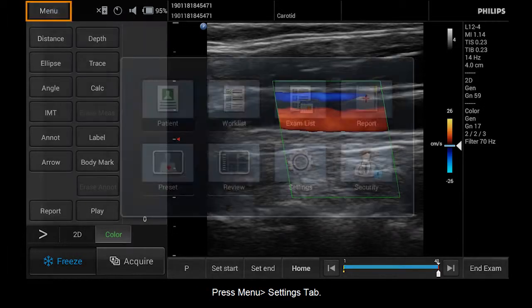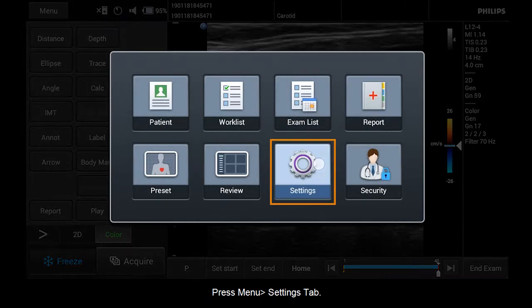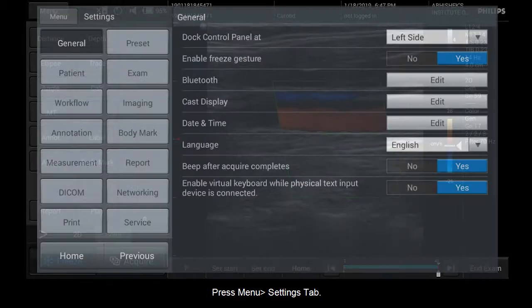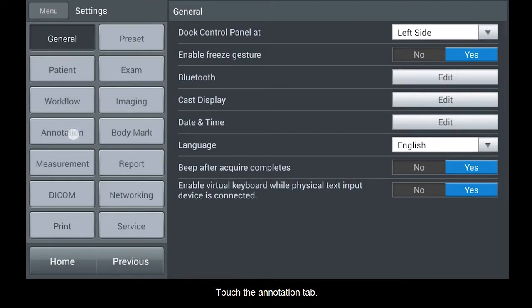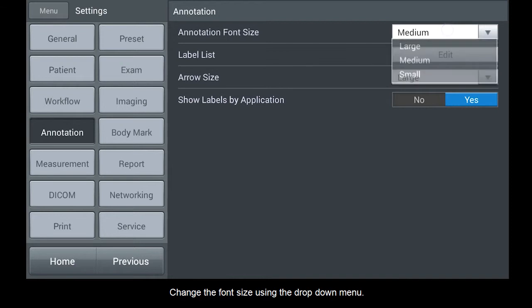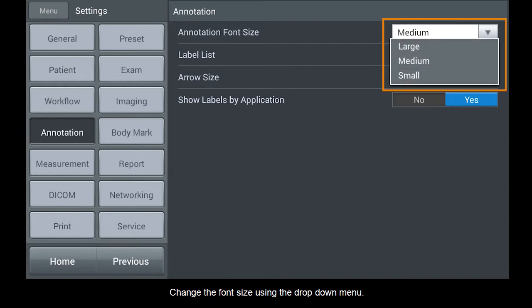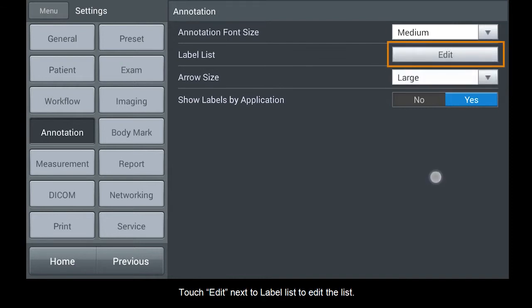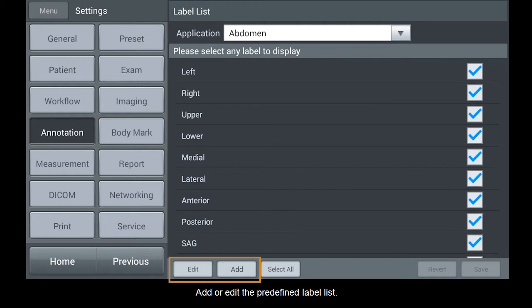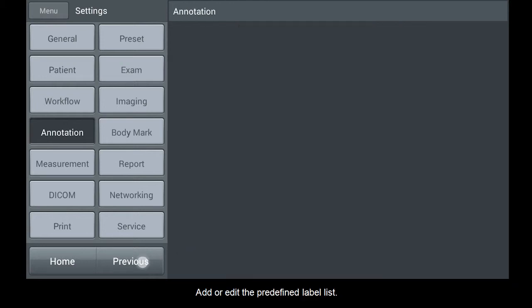Press Menu, then the Settings tab. Touch the Annotation tab. Change the font size using the drop-down menu. Touch Edit next to Label List to edit the list. Add or edit the predefined label list.